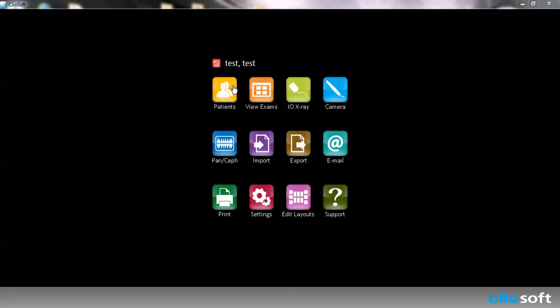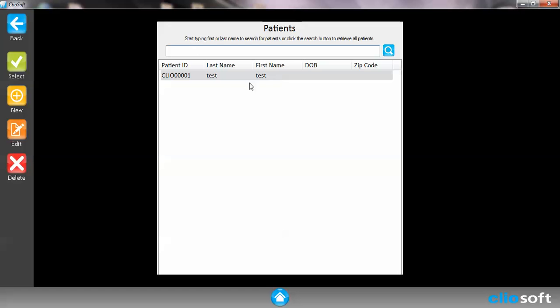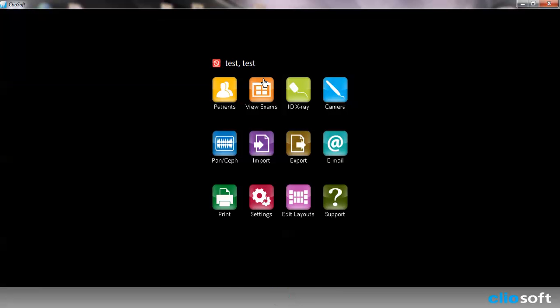First things first, we need to choose a patient. We're going to go ahead and choose a test patient that we've created and then we're going to click on the View Exam.